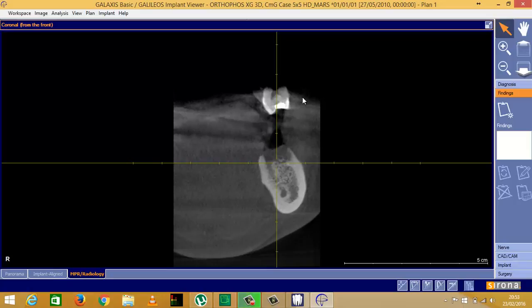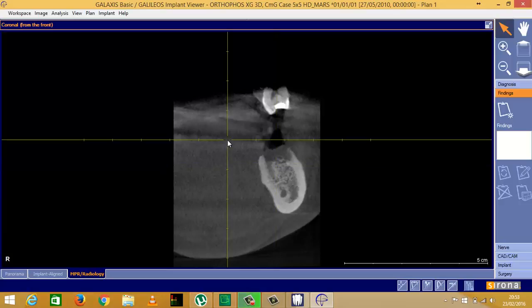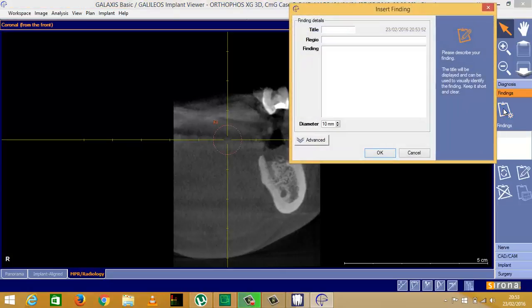Say for example you found something here that you wanted to report a finding on. You just double click there, which puts the crosshairs here. Then you click on new finding, and that gives you a little orange sphere.